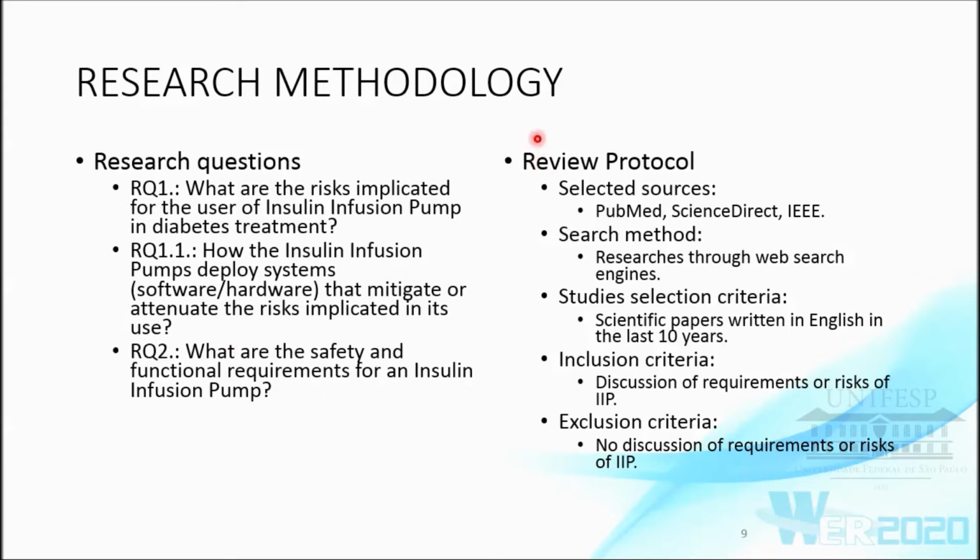Regarding the review protocol, the selected sources were PubMed, ScienceDirect, and IEEE. The search methods were researches through web searches engine. The study selection criteria was scientific paper written in English in the last 10 years. The inclusion criteria was paper that bring discussions of requirements and risks of the insulin infusion pumps.